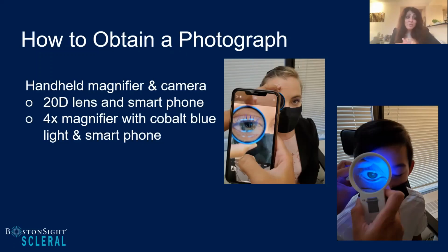Another way that you can use your magnifier or your smartphone freehand is literally just hold it up to the slit lamp through the ocular and use that to grab images that way. It's not easy because you have to have a really steady hand and you've got to be able to position everything and, you know, get everything just right.